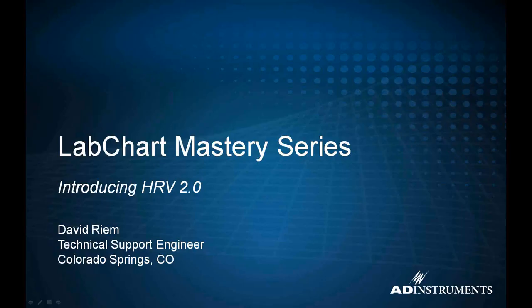Today we're going to be talking about the new HRV 2.0 module. It's been introduced with LabChart 8, and there's been a lot of changes in there, both in the way HRV works as well as the later analysis further down the way with the module. So we'll be talking about that today.